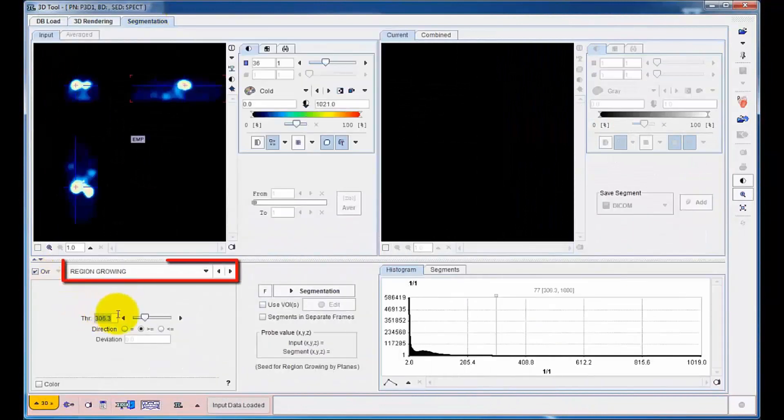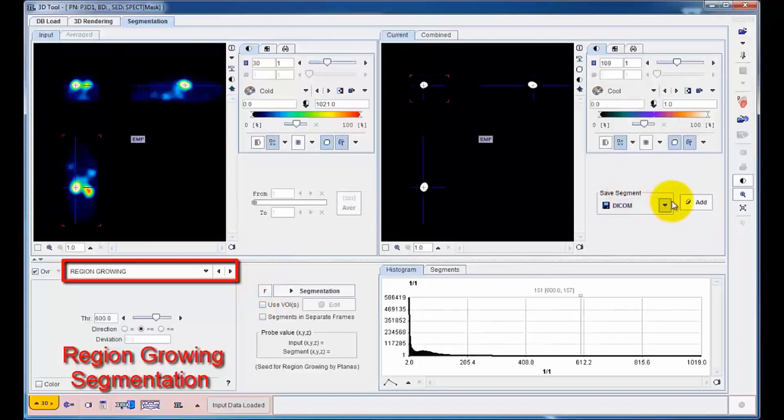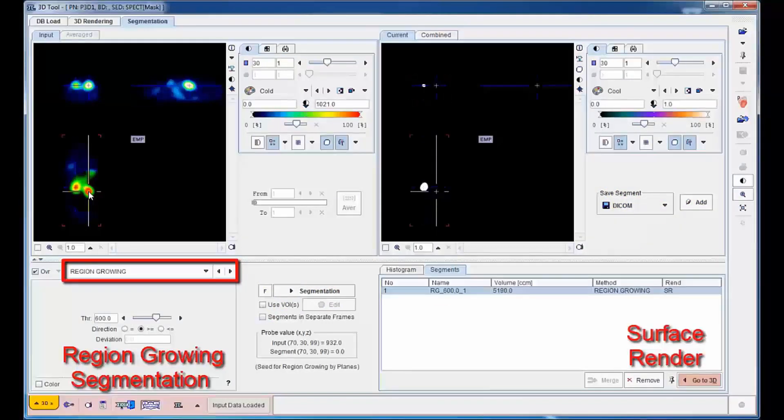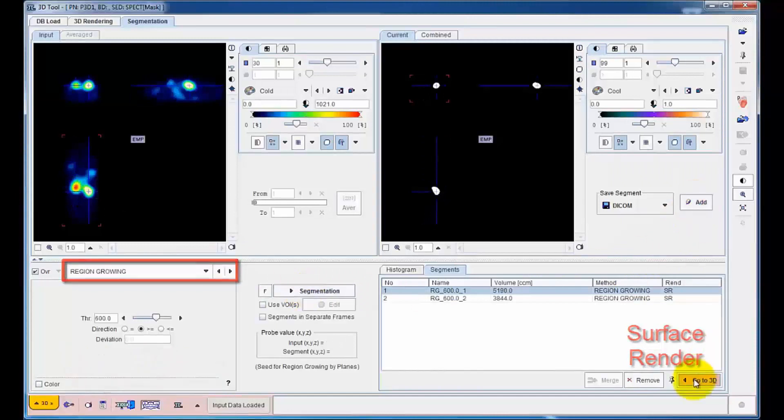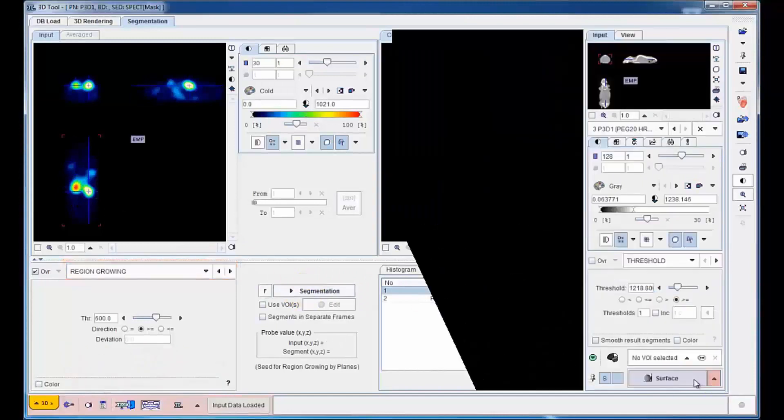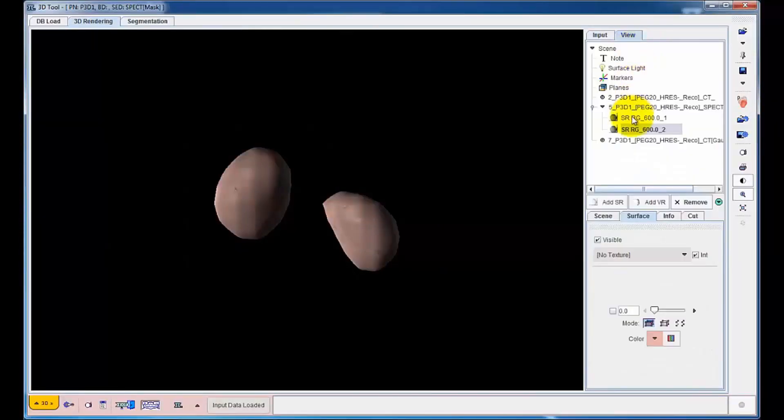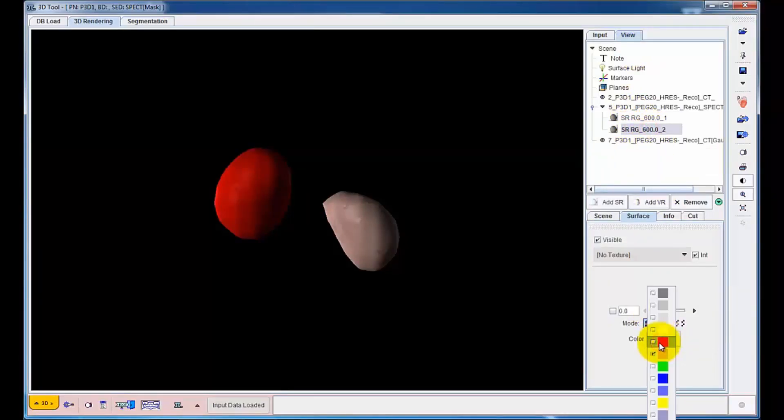All objects rendered in 3D are the result of a segmentation operation. To isolate the kidneys, a region growing segmentation is applied to the corresponding hot spots in the SPECT image. The detected boundaries are then surface rendered and coloured.